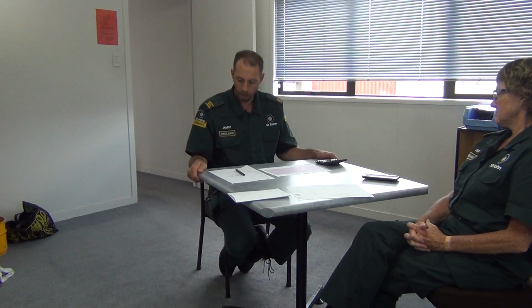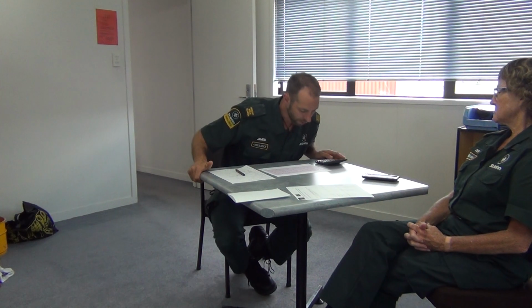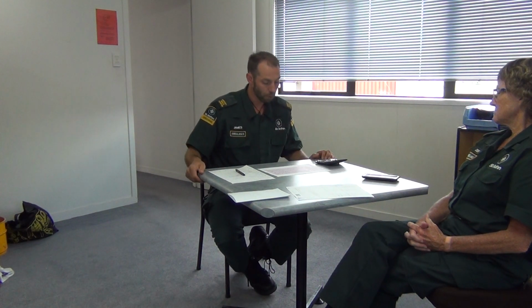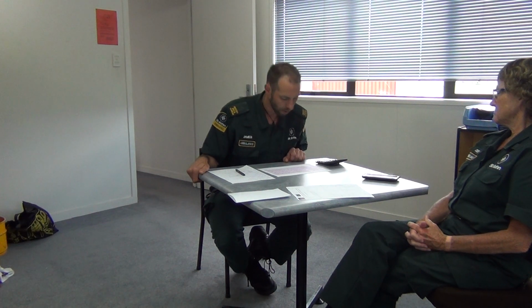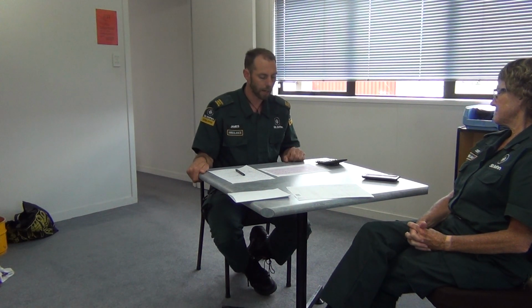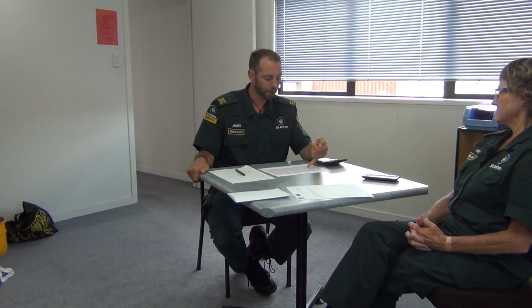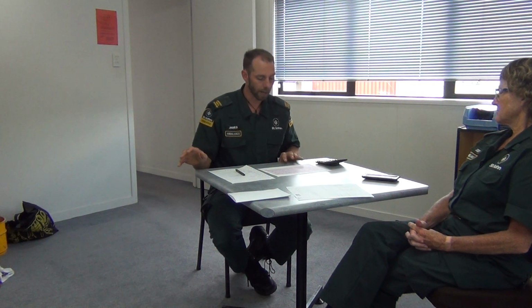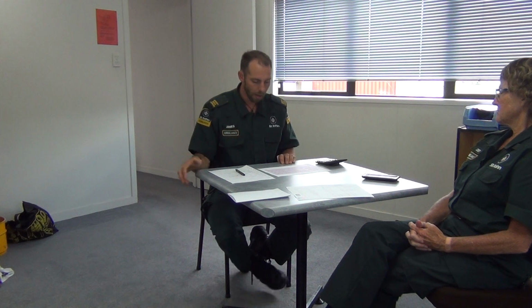There is some left ventricular hypertrophy because in lead 1 the R wave is greater than 12, and in AVL the R wave is greater than 11 millimeters. So that's greater than 12 millimeters in lead 1, greater than 11 millimeters in AVL. So that indicates left ventricular hypertrophy.